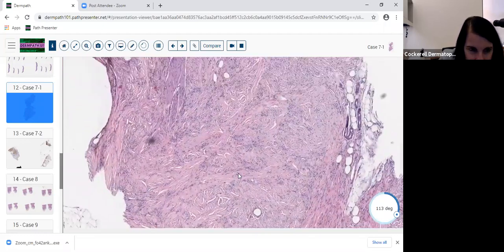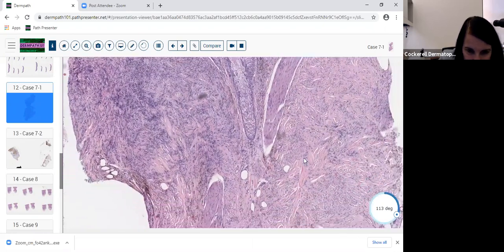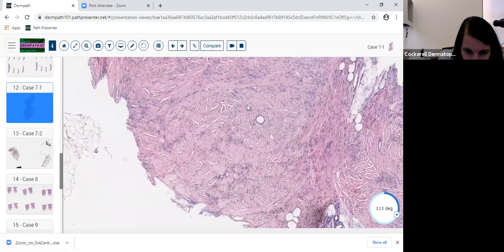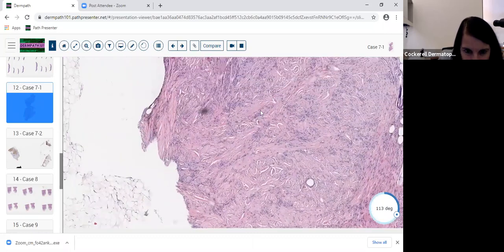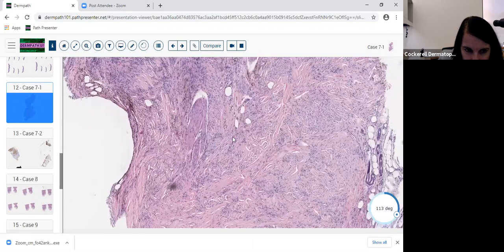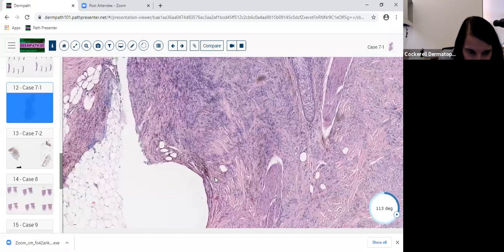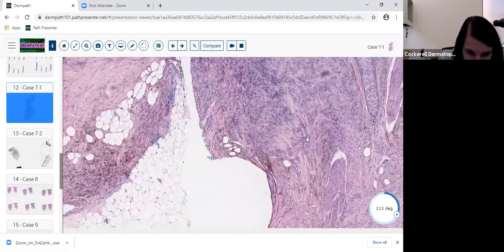Right away, the first thing that you notice is that you're seeing some brown in this tumor, and you're wondering, is this the ink that they put on the punch, or is this truly some kind of pigment? So my eye, I see all these cells and I'm worried a little bit. And right away my eye is drawn to these areas of pigmentation. I'm thinking, wait a minute, this is the edge of the biopsy. Is that just ink? Nope, it's not ink.